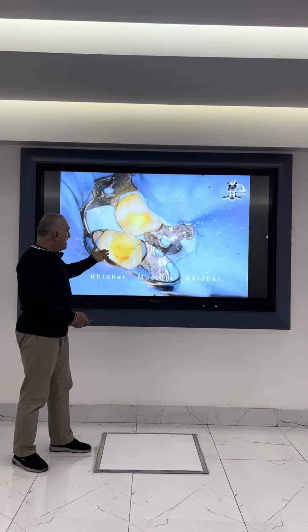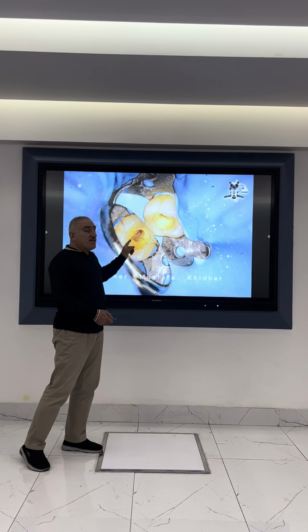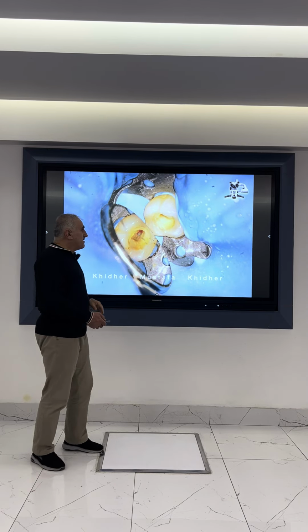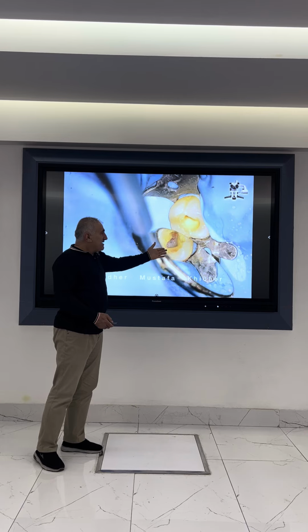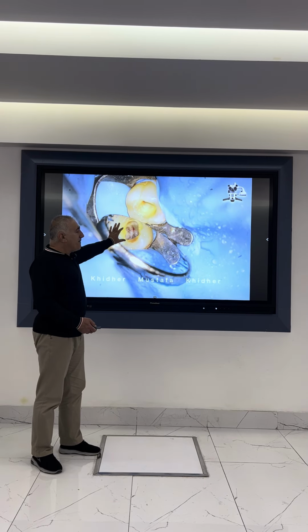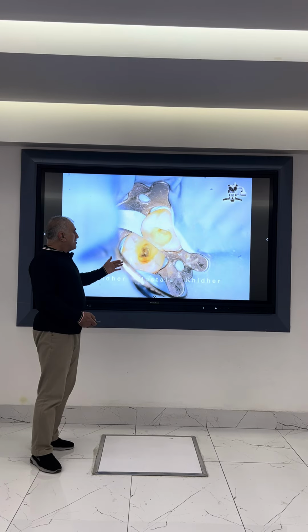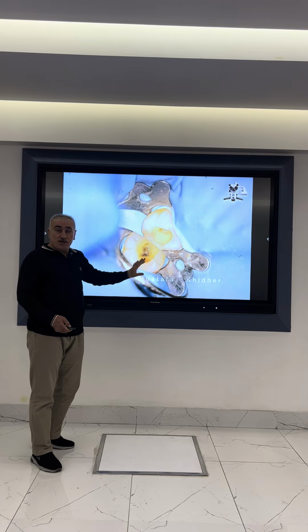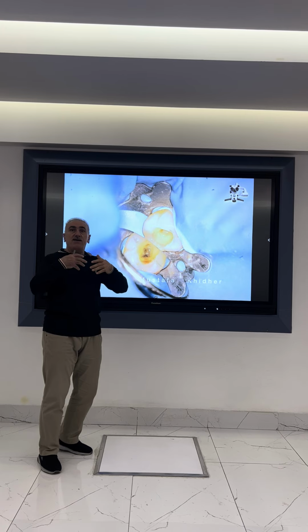After I make the access opening, just a perforation to the pulp, I see that here we have a vital pulp, because in chronic pulpitis we still have some vital tissue inside. So I remove more roof and finally finish the access opening, and here we still have some vital pulp tissue, so we see the bleeding. For every case, what we do is put sodium hypochlorite for at least 10 seconds inside the pulp chamber to prevent any contamination.